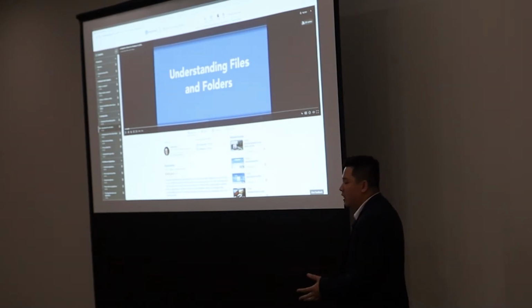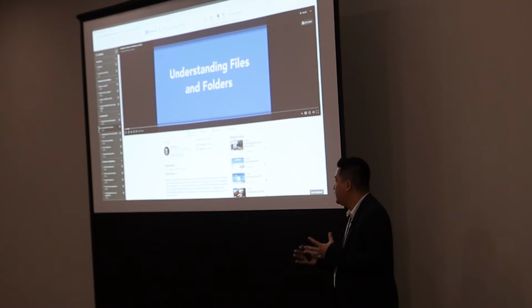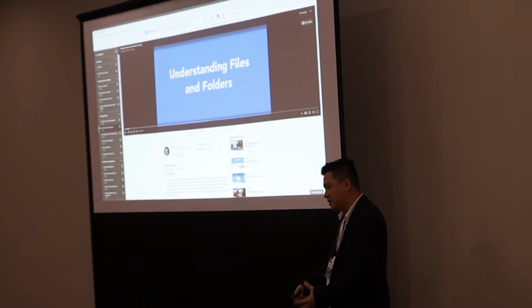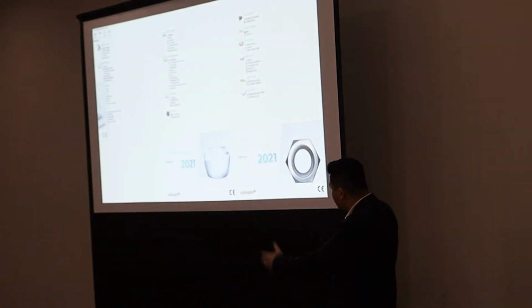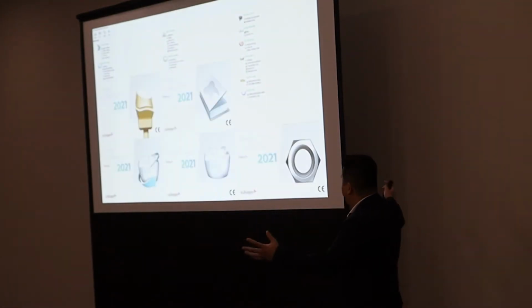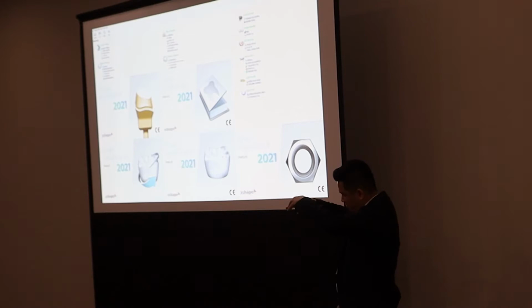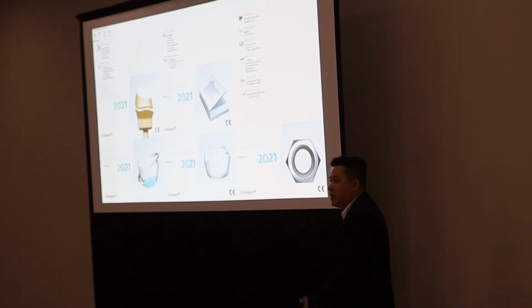And maybe even moving on to a computer programming course, not necessarily to learn the language, but at least to understand some of the concepts there that are really handy in understanding the fundamentals of 3shape as a program and how it works. So of course 3shape is this massive program with all these sub-programs, all these materials, resources, indications, and it's really kind of overwhelming to wrap your head around the concepts and everything there.